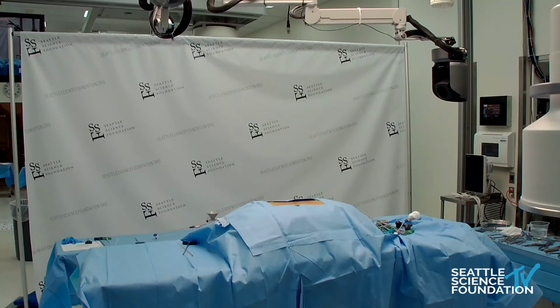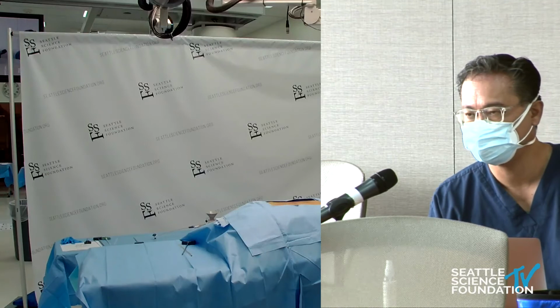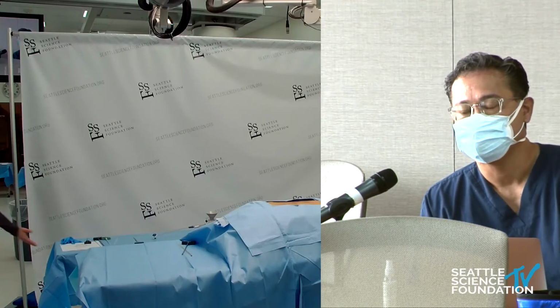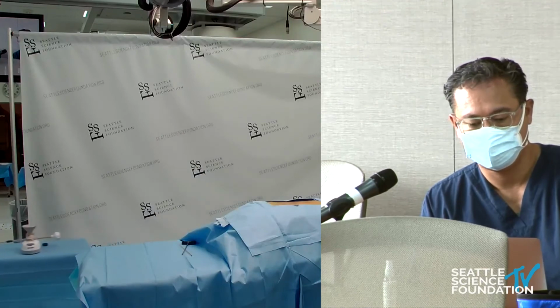The question was how long to wait for cement to cure before a patient can ambulate? So by the time the cement is in the body, the working time for the cement that we used, the Striker HV, is about 8-9 minutes. By the time the person rolls over, the cement will be hardened.